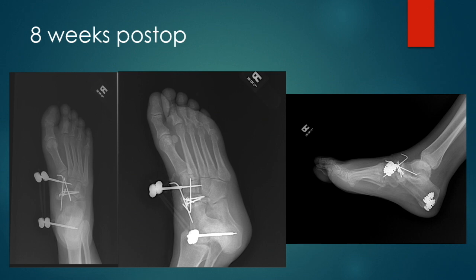What that frame does is it helps to maintain my midfoot medial length, because this fracture is constantly trying to fall into varus, just like all the rest of the world. And those screws and those tiny little pins are not going to fight against that effectively enough. So the frame is maintained during the entire length of his treatment, and that's why it kind of fits this talk a little bit, because that whole idea of using your frame alone with nothing else is not really what we're suggesting. We're suggesting to incorporate your frame in unique or novel ways and carry it through a good portion of the treatment plan, perhaps the entire treatment plan, and this is another example of that, a kind of combination technique. So that frame is critically important in maintaining this medial column here, and he's fairly fresh, so we'll see how he does, but at least his wounds are healing and his pin tracks are clean.